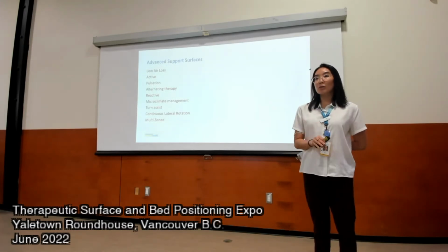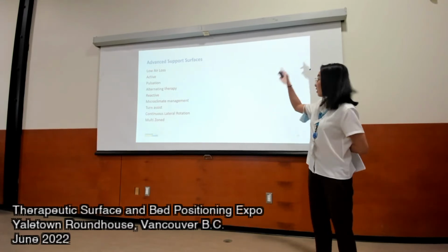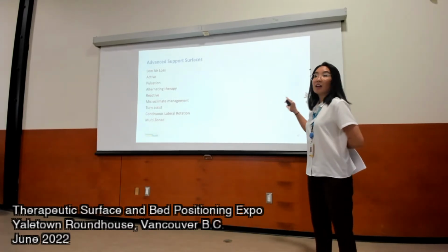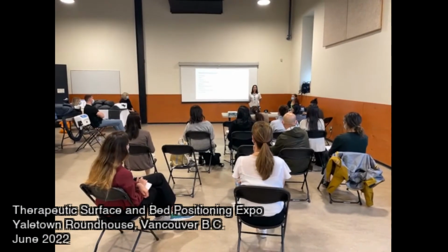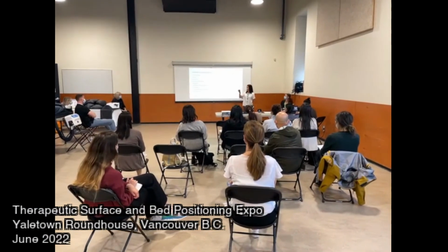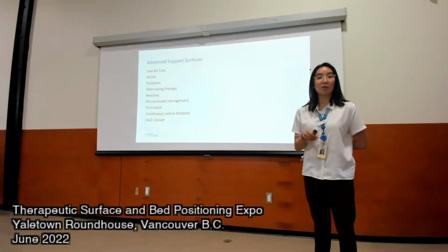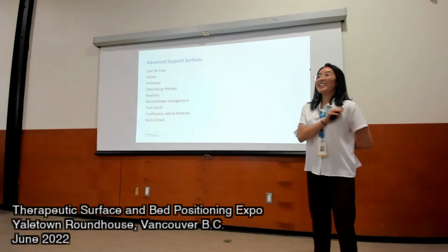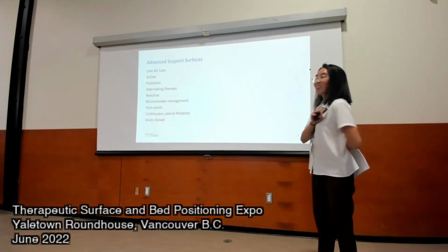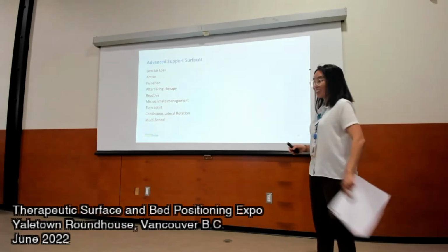I'm not going to go into too much detail because if you go onto the Click website, you can see the definitions of all of these things, but I highly recommend that you go through and ask all of our reps here for information about what features each of these mattresses have, and then you can link them up to the products that we have. Okay? But the one thing we can't stress more is that these do not replace repositioning. You still have to reposition the resident on these mattresses.